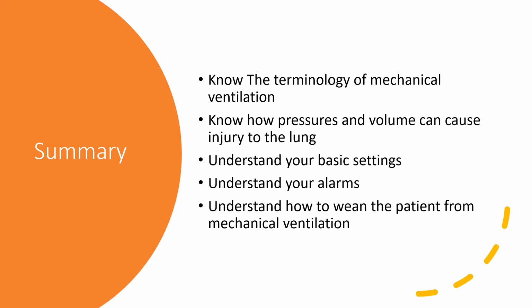Now, I know I blazed right across that, but weaning is really important. If you're going to intubate someone, know how to get them off the ventilator as effectively as you can. A lot of times patients who are weaned from mechanical ventilation are put on BiPAP. In other words, they have some kind of non-invasive support on extubation, which is a valuable tool.